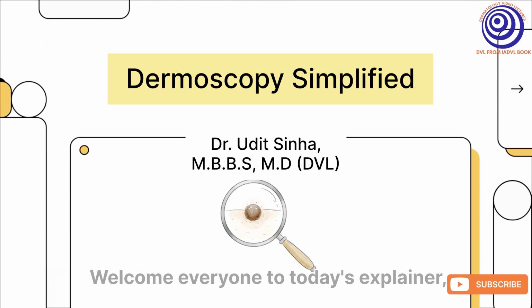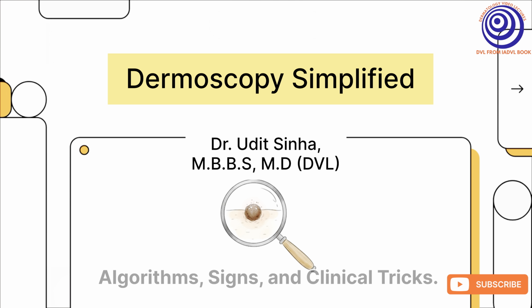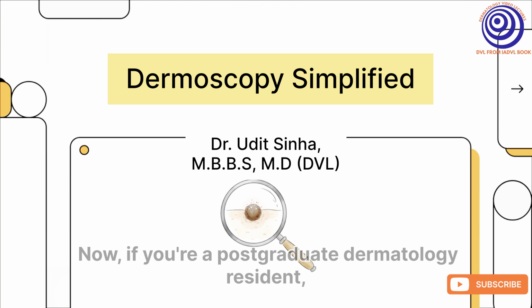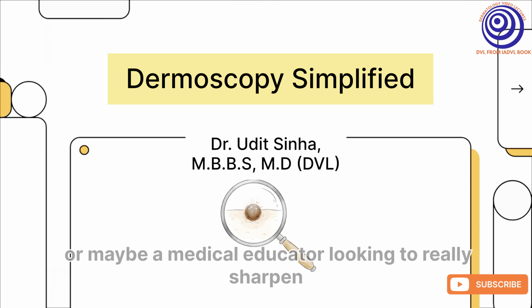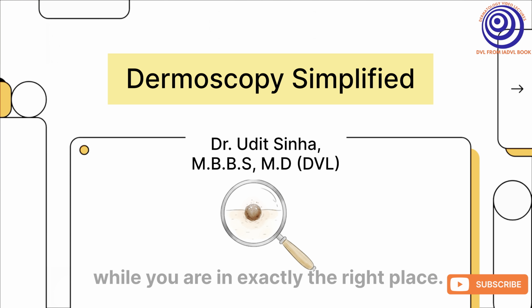Welcome everyone to today's explainer, Advanced Dermoscopy of Pigmented Lesions: Algorithms, Signs, and Clinical Tricks. Now, if you're a postgraduate dermatology resident, a clinical dermatologist, or maybe a medical educator looking to really sharpen that diagnostic edge, well, you are in exactly the right place.